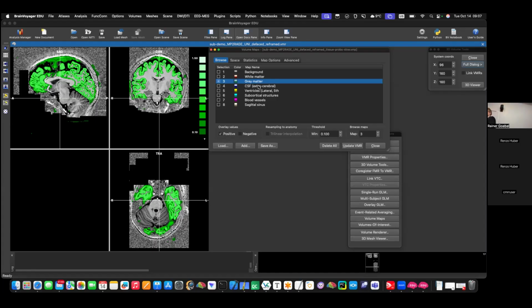But sometimes things work unexpectedly, so it would be nice to try. You interpolate your slab to 0.7 and feed the slab, and it should in principle work. I mean, you could equalize the histogram from your data to the MP2RAGE range. Yeah, I was thinking of a slab MP2RAGE. Oh yeah, that should also work.